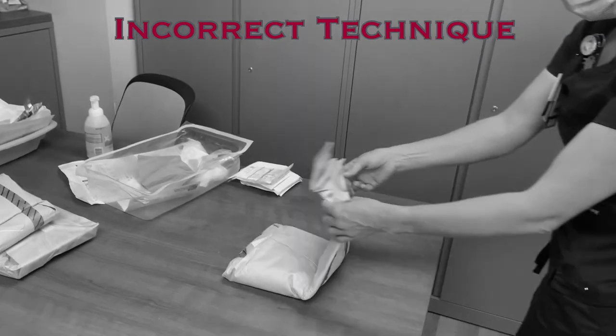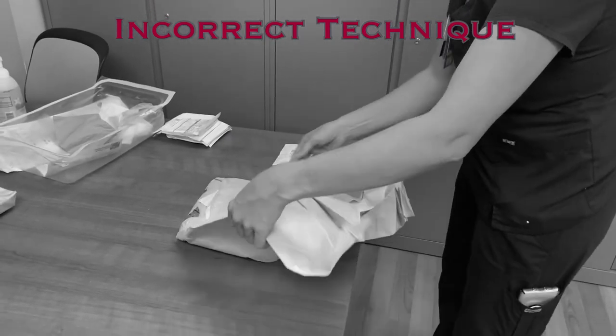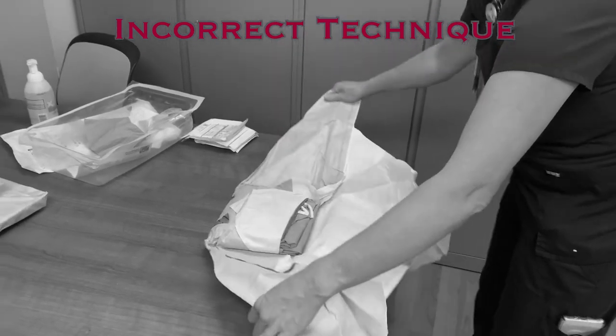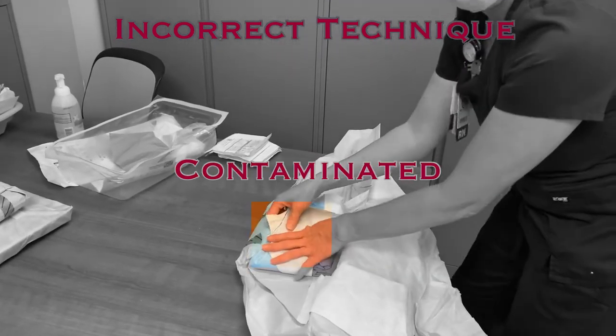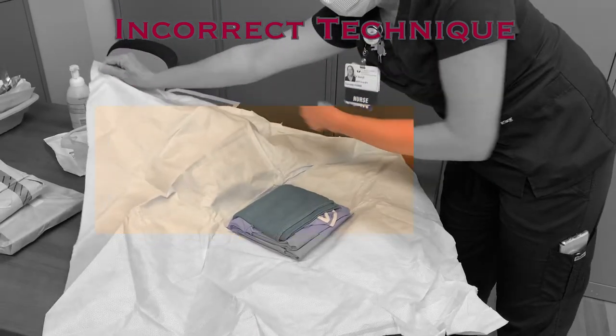If the drape is opened inappropriately, it will cause contamination of the field. Opening the first flap toward you will force you to reach over the sterile field to open the final flap. Reaching over a sterile field while not wearing a sterile gown contaminates the field, and you will need to restart with new supplies.